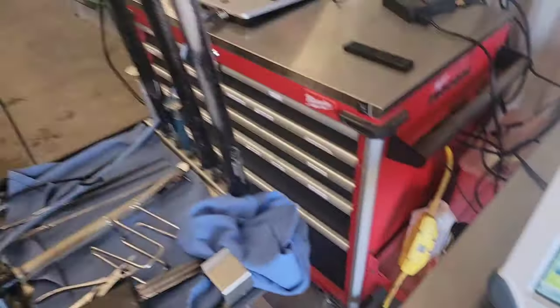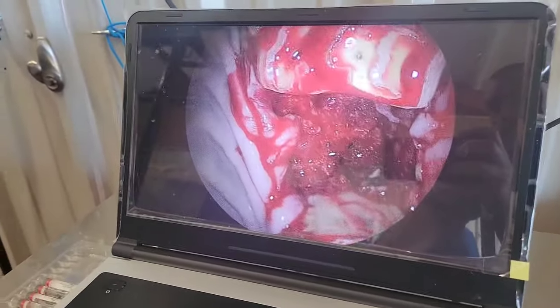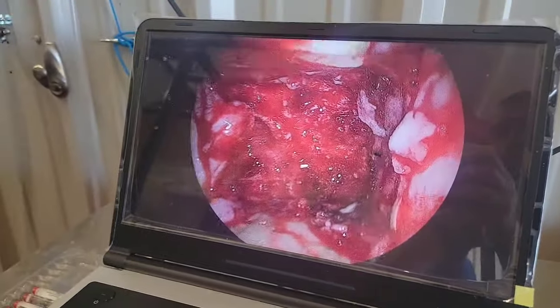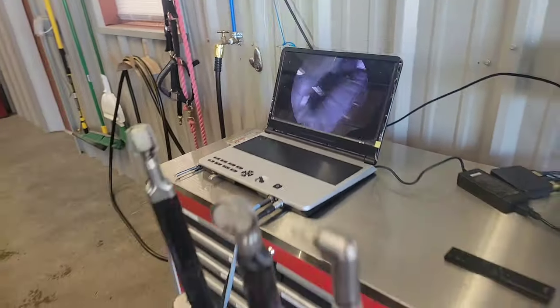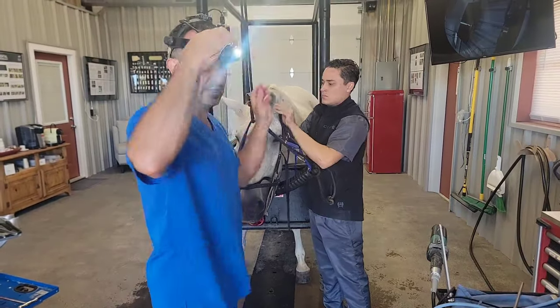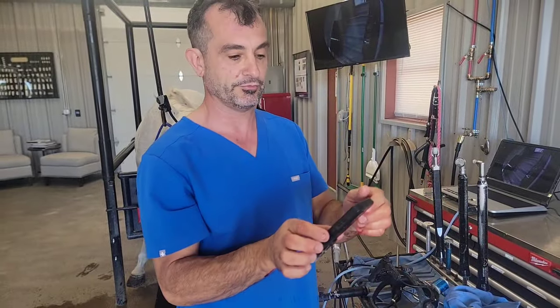We've got the tooth out. We're going to show you guys what the socket looks like, and now we're going to take an x-ray. I don't know exactly how long it took, but we'll show you the phone so you can see the time — we're not making it up. Everything went really well. We'll check the time — it's 10:03.